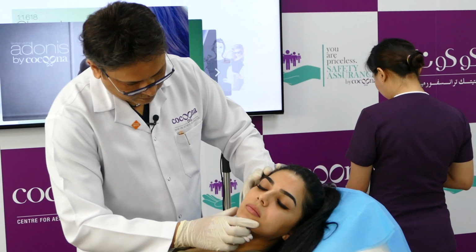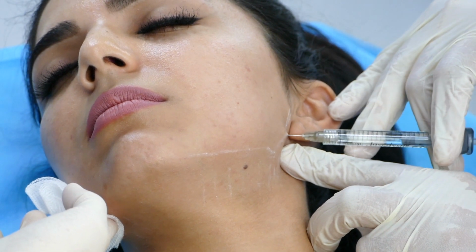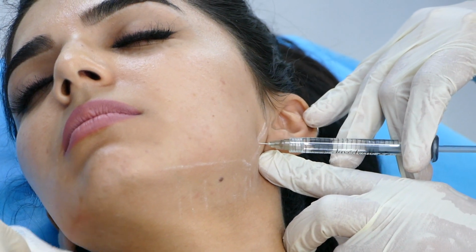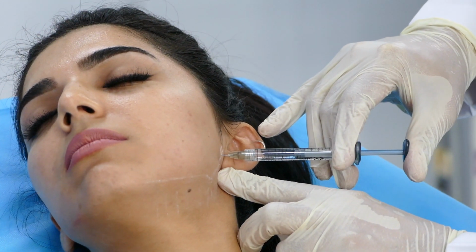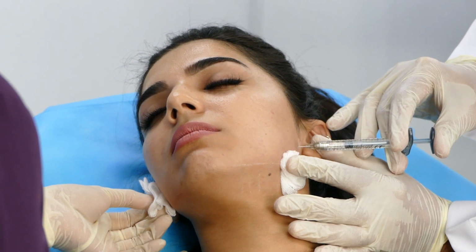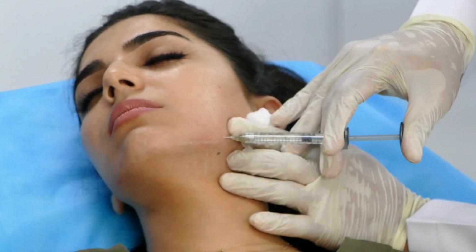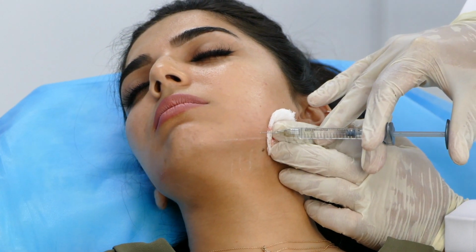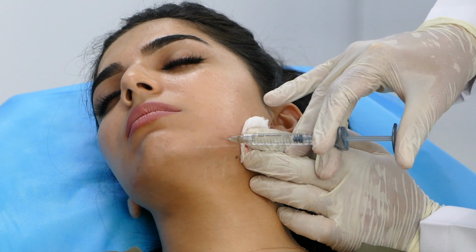And then I'm starting the filler injection, first building up the vertical ramus of the mandible and then injecting along the horizontal ramus. I'm using the needle method by injecting droplets of filler just deep to subcutaneous tissue, a series of injections all along the vertical border and the horizontal border of the mandible. Care needs to be taken when you reach the pre-jowl area where the facial artery crosses the mandibular bone.